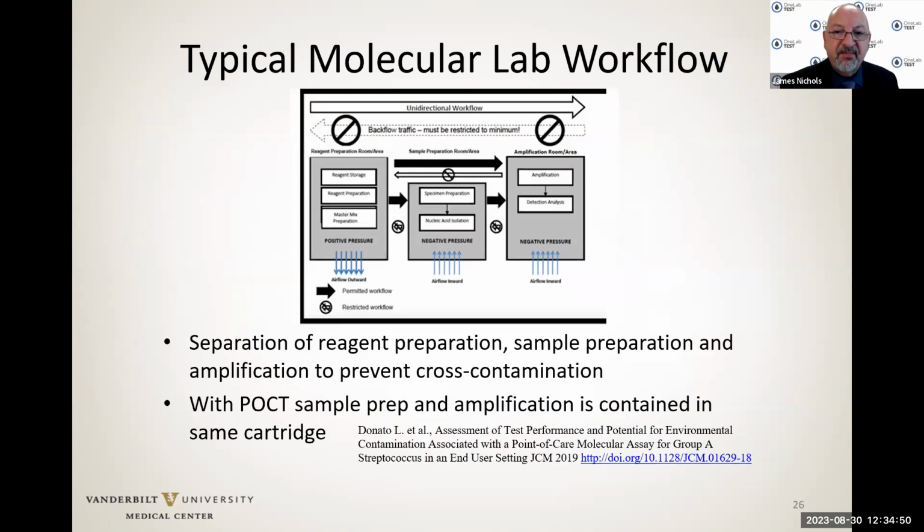This is where we separate reagent preparation and storage from specimen preparation steps to amplification steps. And we have a unidirectional workflow so that the amplicons that we do in the last step before detection don't make it back to the areas that we're preparing reagents, because that would cross-contaminate, cause false positives.